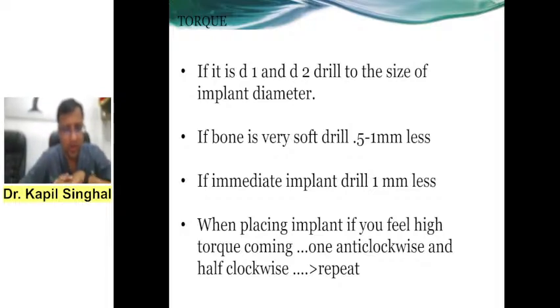So torque we have already discussed. If the bone is very soft, we will drill 0.5 maybe 1 mm less. For an immediate implant, I will drill again 0.5 or maybe 1 mm less.